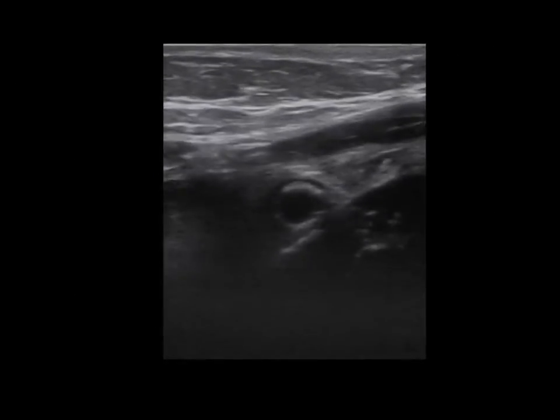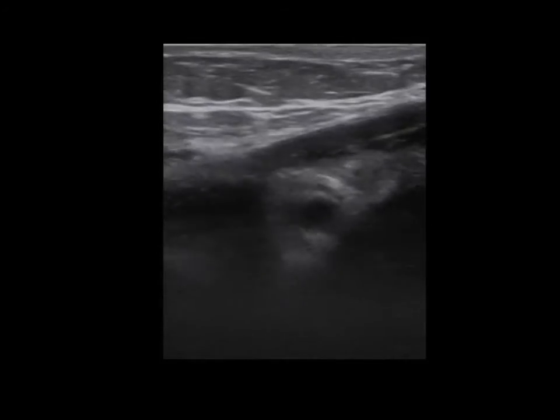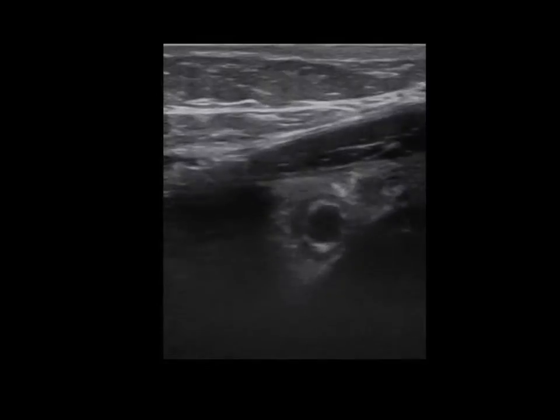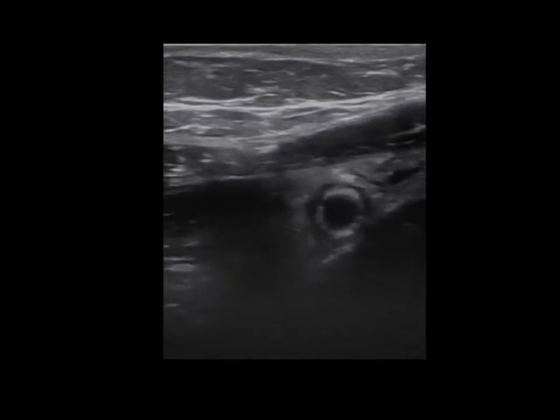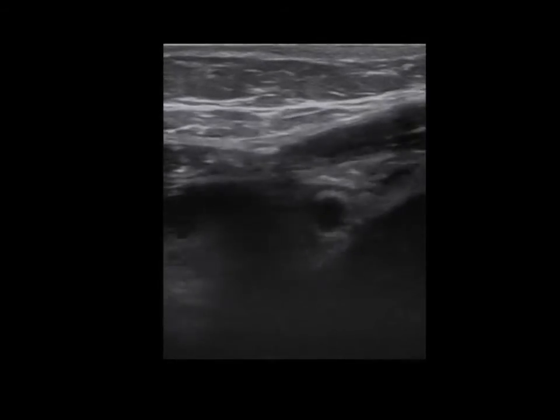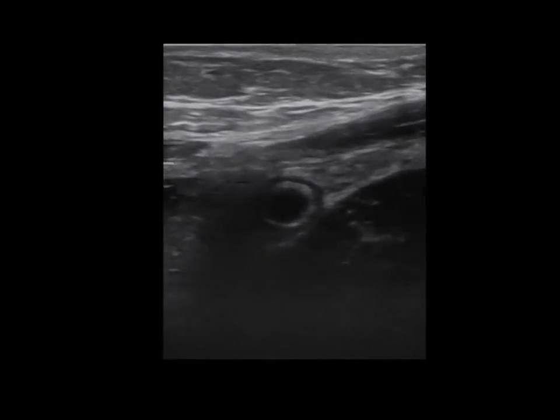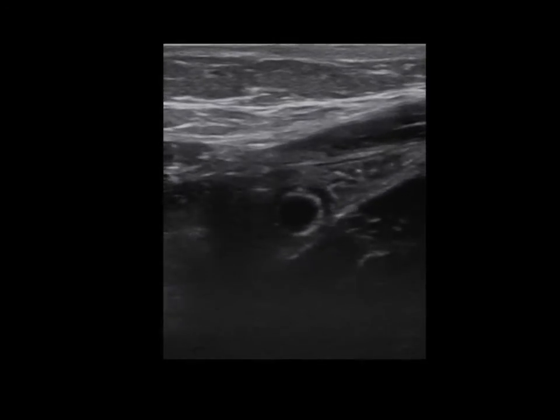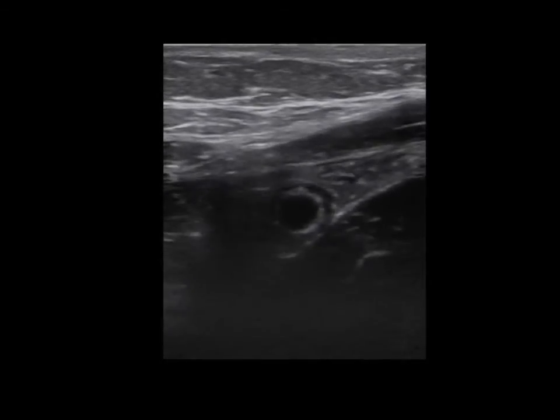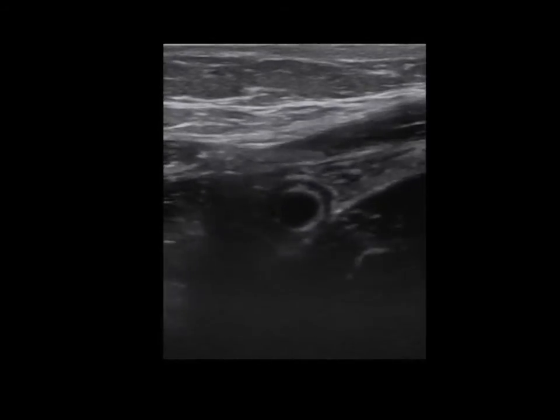And here's the same appendix. Now we're in the transverse view. Again, you've got abdominal wall musculature above. And as we look posteriorly, we see this bullseye appearance of a non-compressible structure that is not peristalsing, surrounded by some fat stranding or fat enhancement indicative of an infection. Now you can freeze this frame and measure the appendix from top to bottom and look to see whether it's greater than 6 millimeters in diameter.